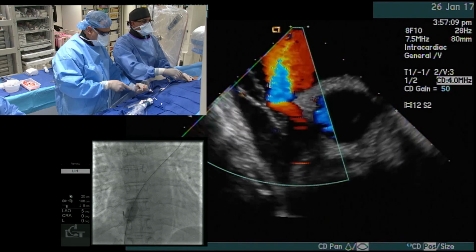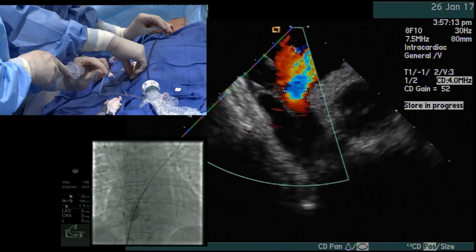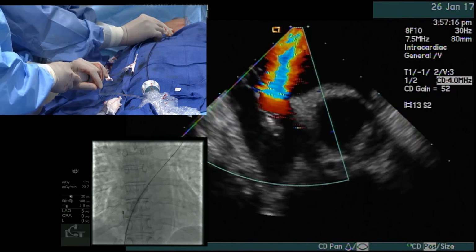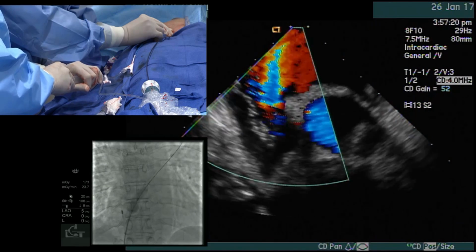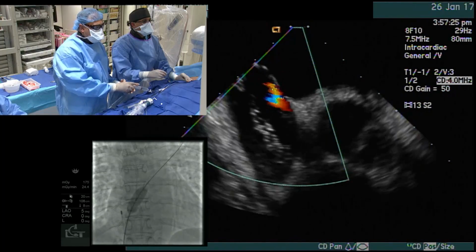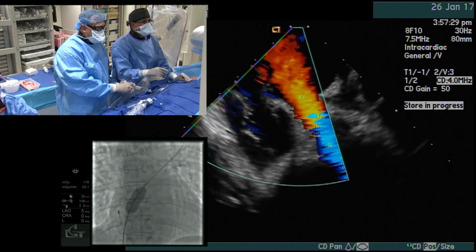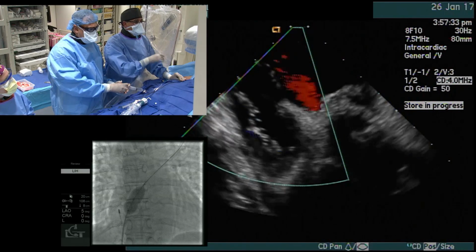Hold on one second, Andreas. Let me just get some of the juice out here. Okay, that's better. Just keep a little pressure on it. Okay, I like this better. So you can see that the posterior rim is causing indentation on that balloon. And now I have the flow totally occluded. So you just hold it there. Okay, now can you measure that for me?